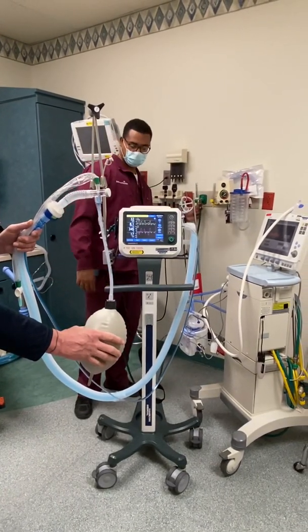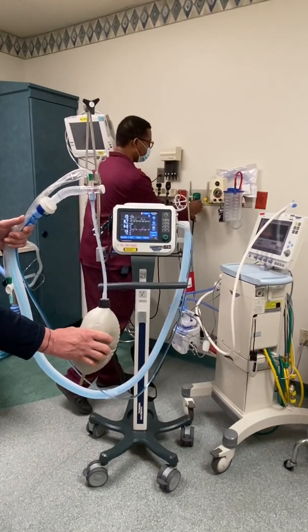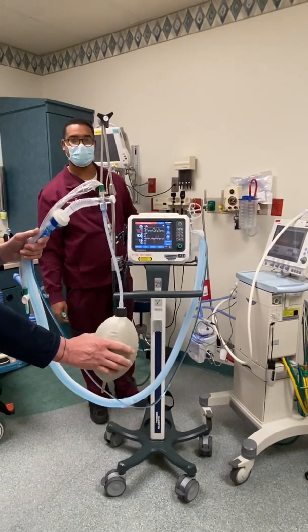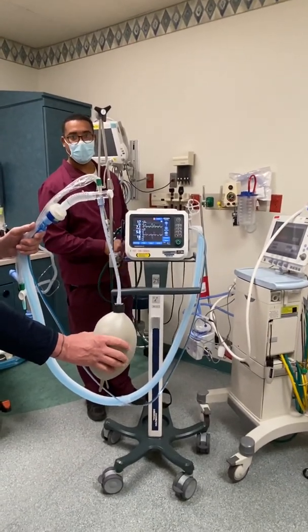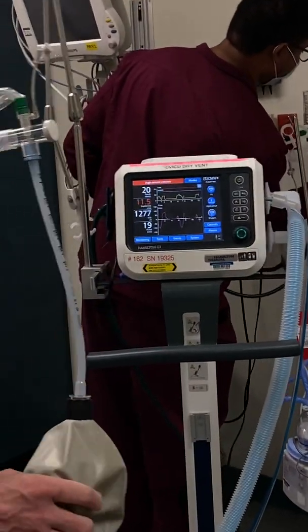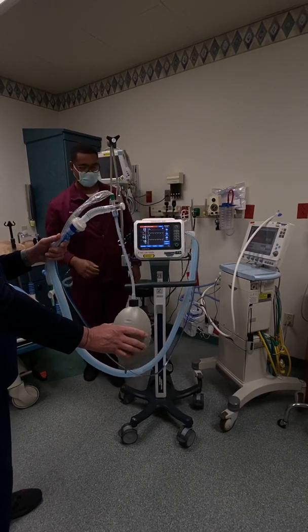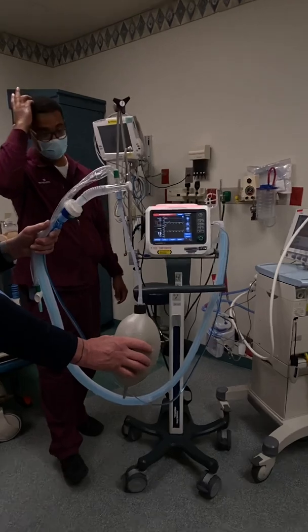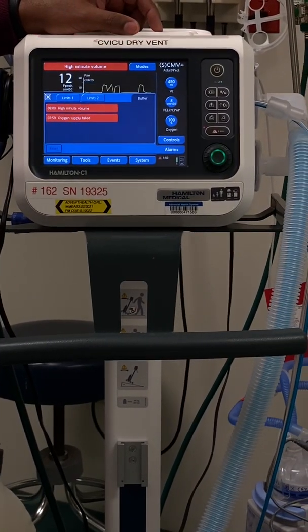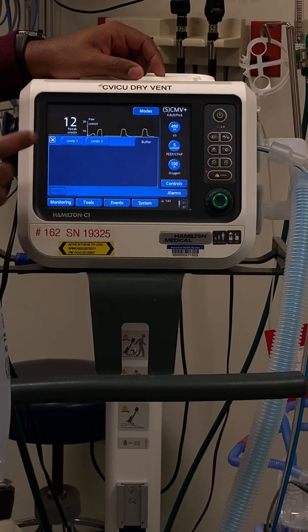If you have to go on a transport, disconnect from the wall. There should be an O2 tank on the back — just screw the connector onto it and you're ready for transport. Make sure there is actually a full tank to work with. To check alarm history, touch the alarms button and it will tell you what's been alarming. To clear it, just hit reset and exit.